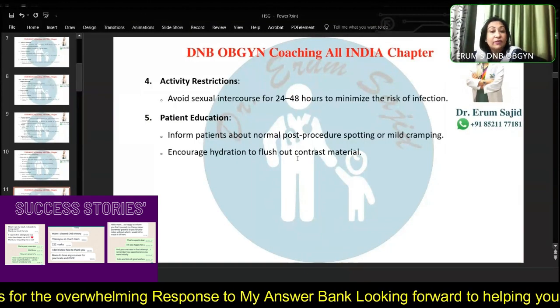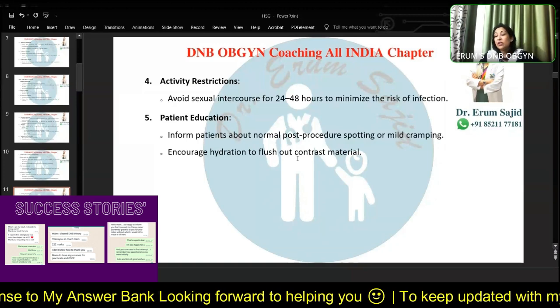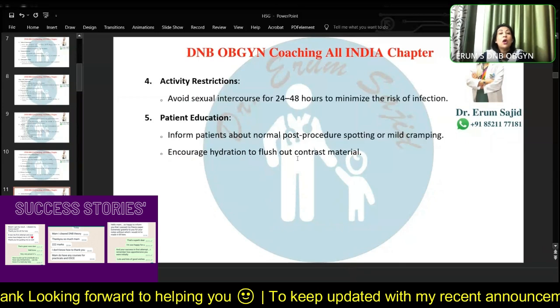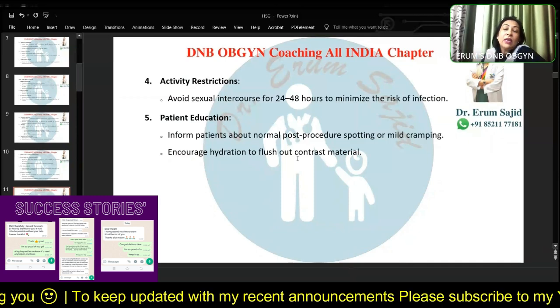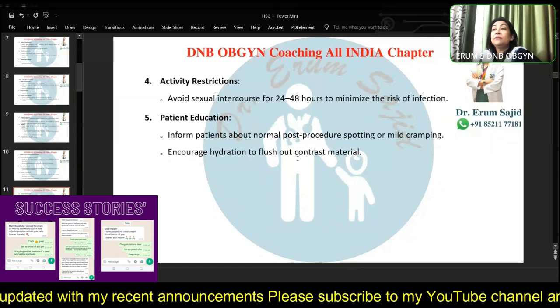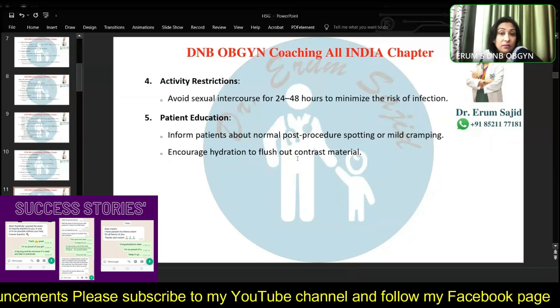Yeah. See, they will not agree with 20 ml, but practically 20 ml is usually required when we do HSG. And I'm sure you must have all done HSG at some point in time. You also know how small 10 ml is, and sometimes it does not give you a proper result. So practically speaking, I usually go for at least 15 to 20 ml, but you can speak in the exam as per 10 ml. See, what is written in the procedure was only 5 ml.